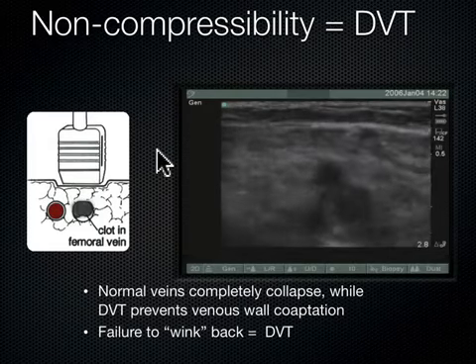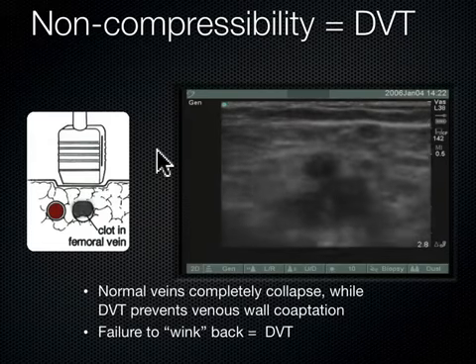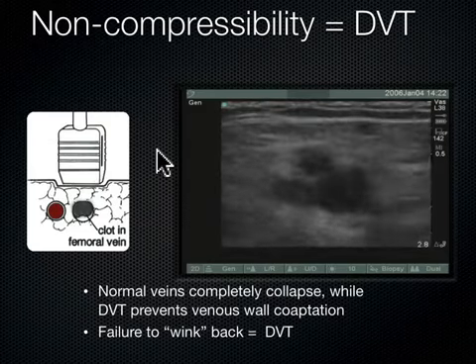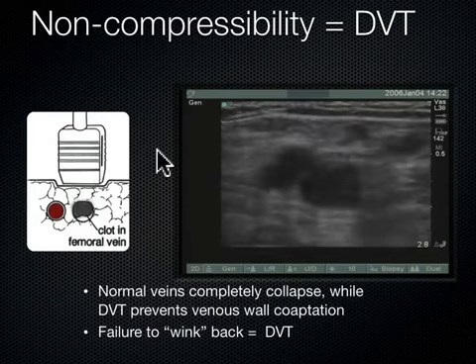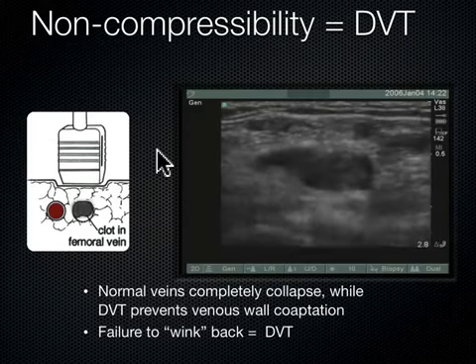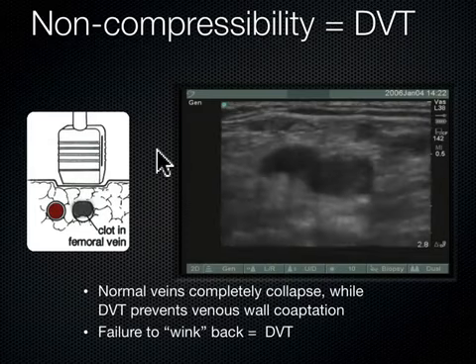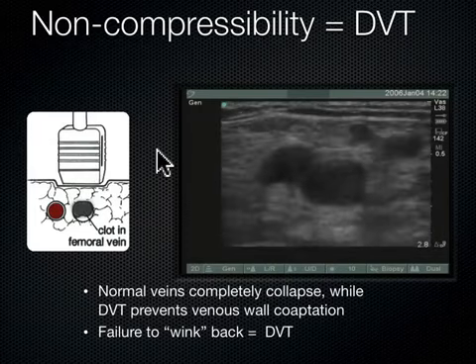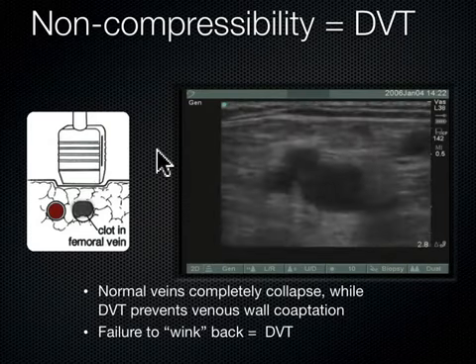Okay. So when you do identify a clot, that's great. You want to record it on video and lock that in and then stop compressing. Okay? The machines all record video. You want to capture the video and show that loop to the people around you, other students, the attending, whoever, the patient. But if you keep compressing that, you could potentially dislodge it, right? So that's why whenever I see one, I get called in the room and everybody's bouncing on this clot. I'm like, whoa, whoa, whoa, stop, everybody, stop. Okay, enough teaching on the patient. Let's go ahead and start treating the patient.